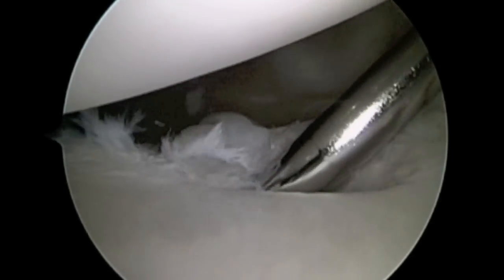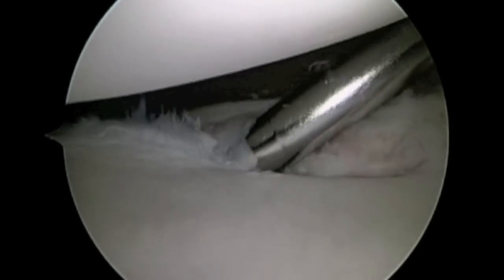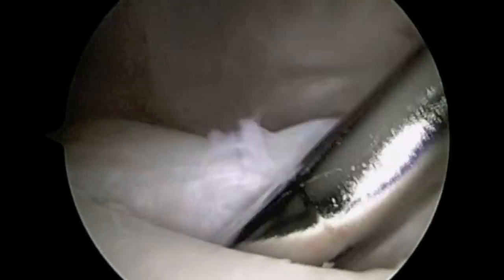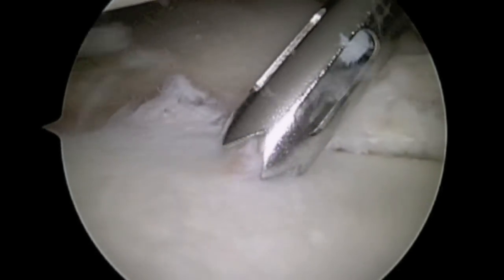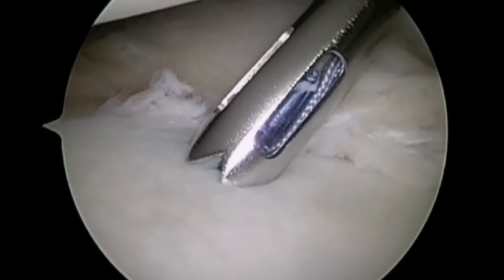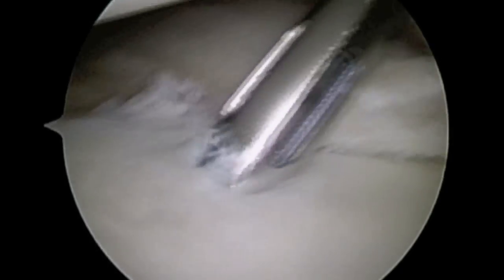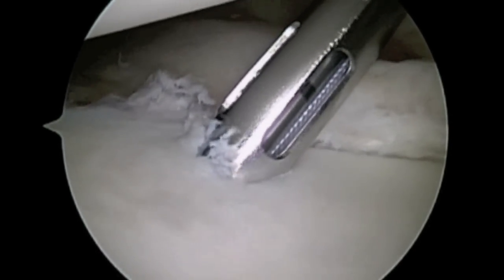A shaver is also used to help stimulate a bleeding response and remove abnormal tissue from the labrum. A pilot hole is being drilled for placement of a suture anchor. This suture anchor is impacted into the glenoid below the surface, embedded in bone, and the sutures allow us to repair the labrum to the edge of the glenoid.